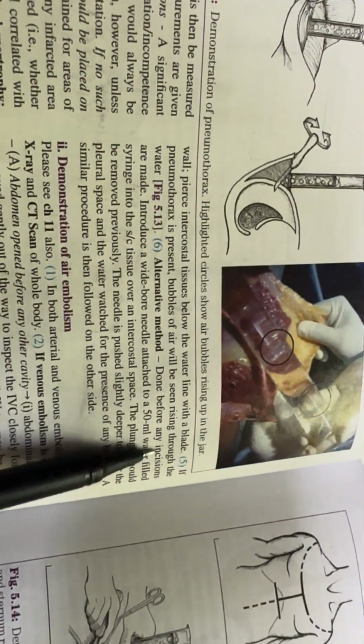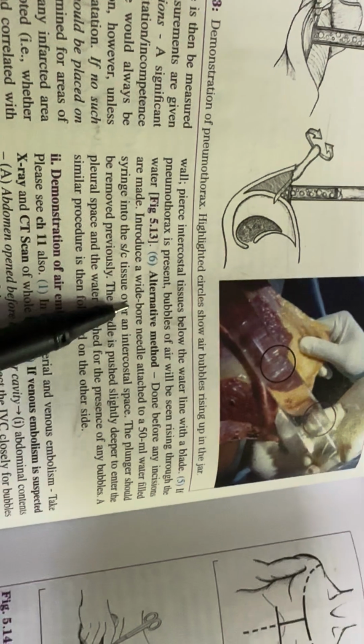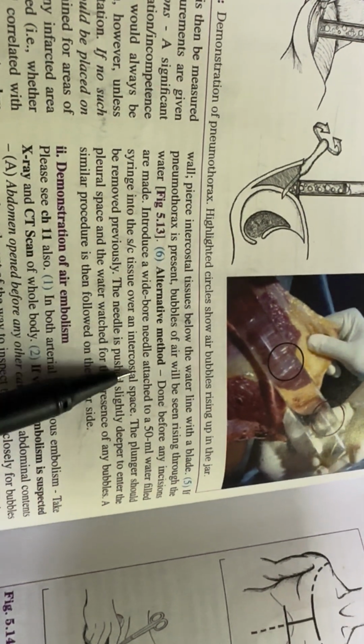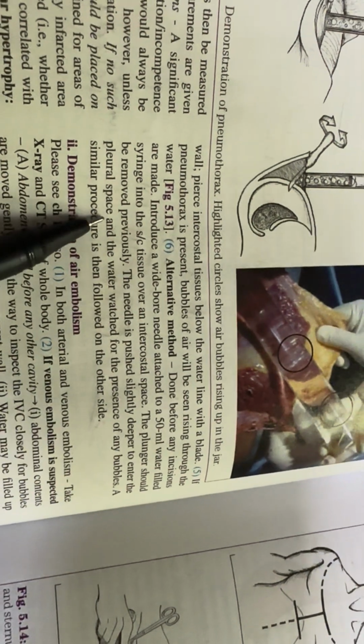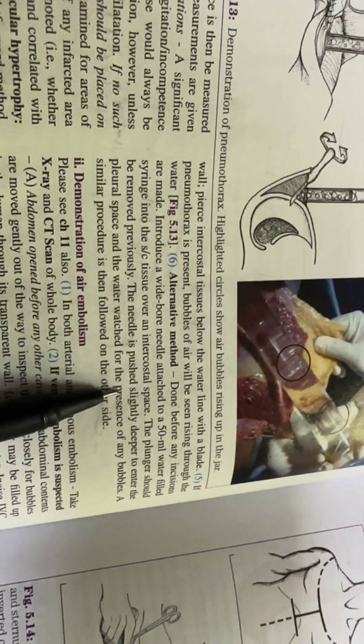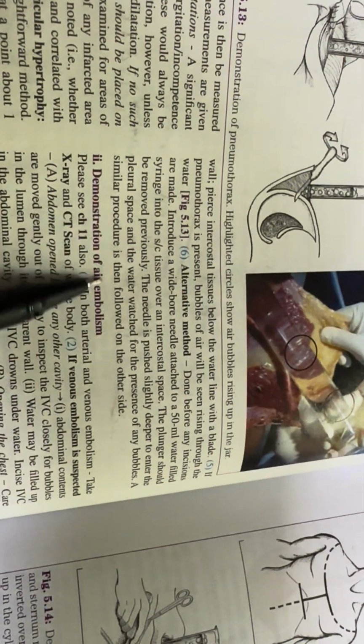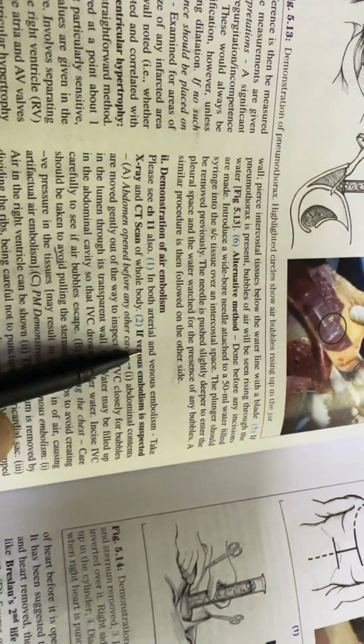Alternate method, done before any incision is made. Introduce a wide bore needle attached to a 50 ml water-filled syringe into the subcutaneous tissue over an intercostal space. The plunger should be removed previously. The needle is pushed deep to enter the pleural space and the water watched for the presence of any bubbles. A similar procedure is then followed on the other side.